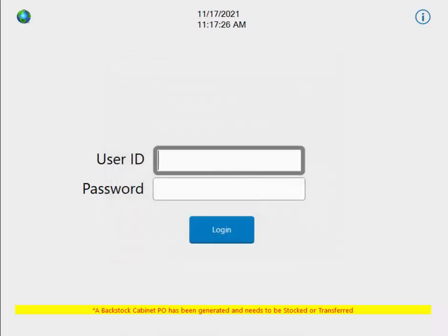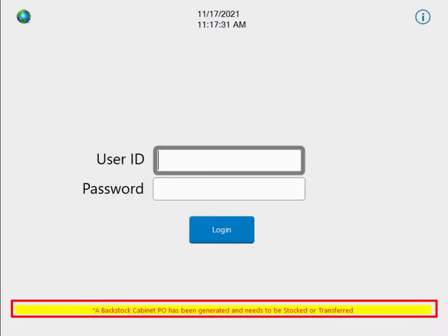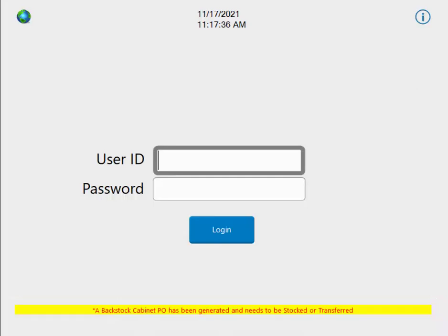In 38.12, if you are using the backstock workflow, you will now see a yellow banner at the bottom of the login screen letting you know if there are active stock items that are at or below minimum. When you log in and select the restock button, the PO will then generate for backstock items.